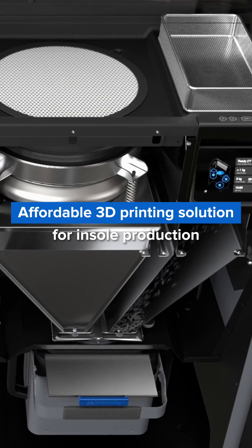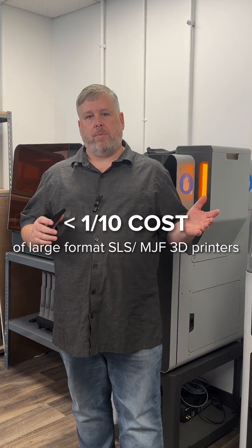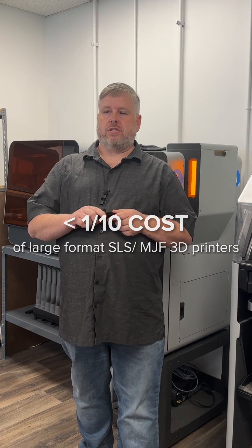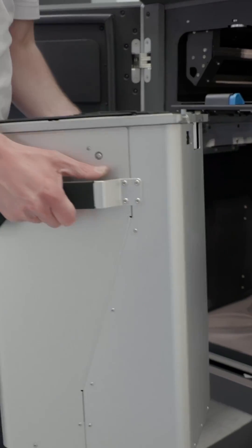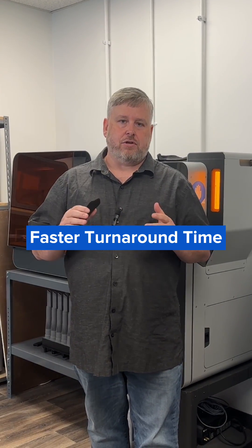Now what does that mean? Formlabs is the most affordable 3D printing solution for insole production today. Our printing solution is less than one-tenth the cost of the large format SLS and MJF printers. Now with the lower cost, you can scale your production as you need it. Start small and add more printers as your orders increase. Fill those orders faster.